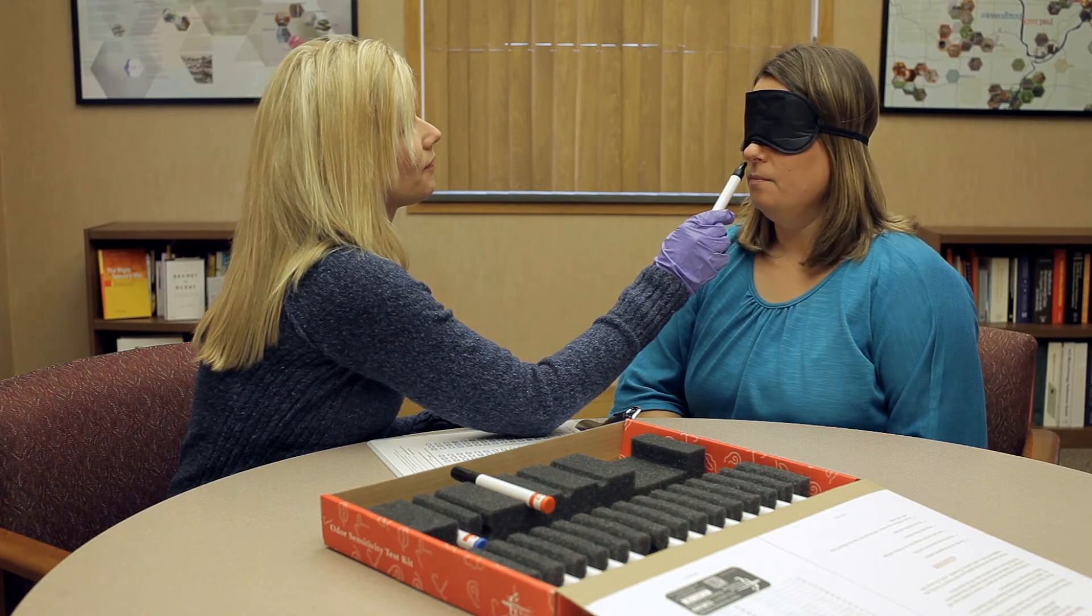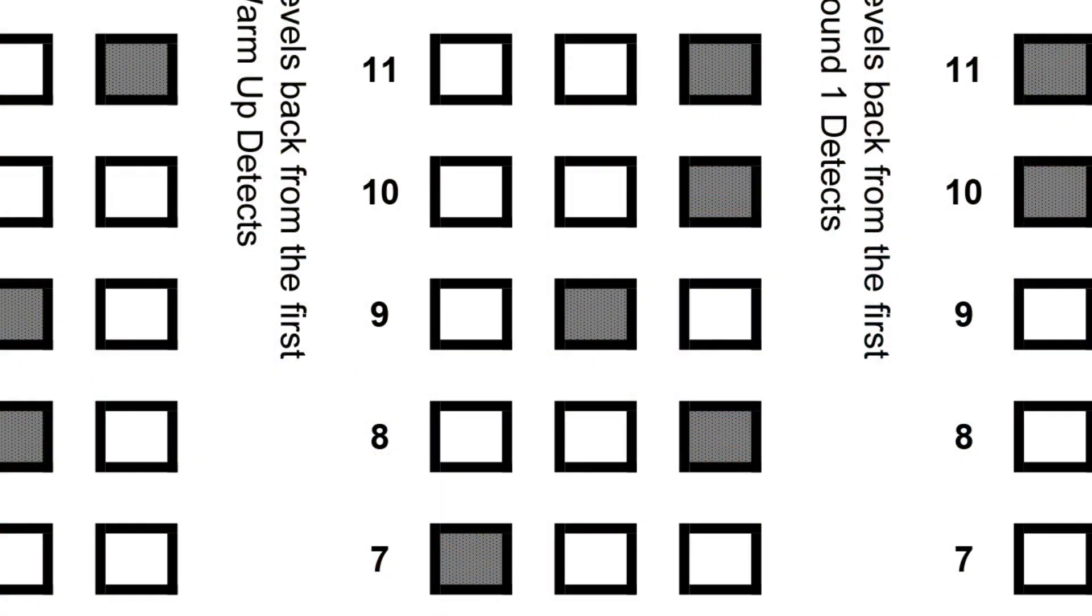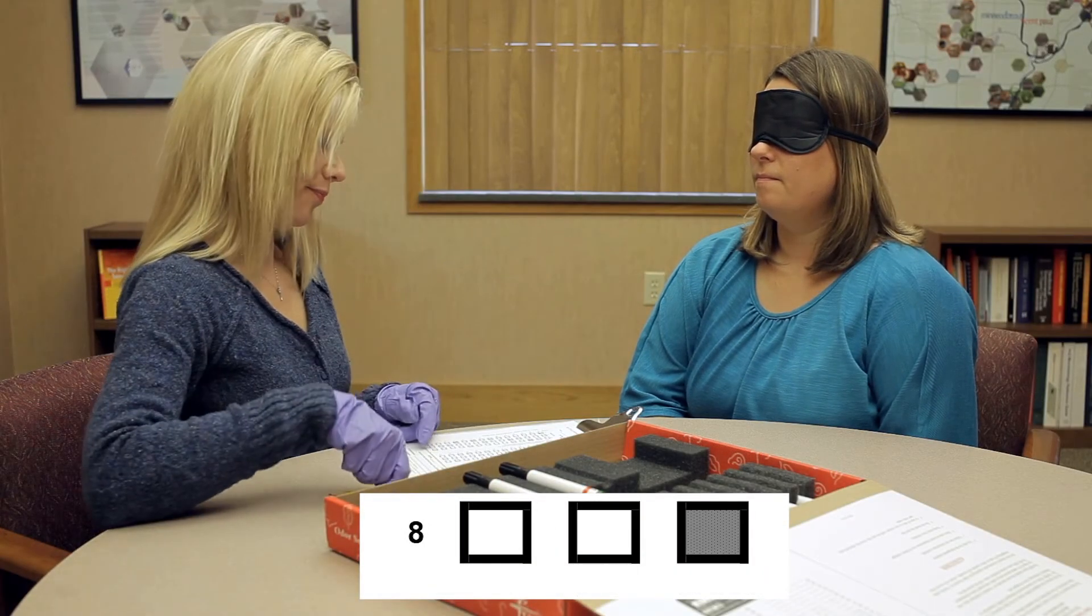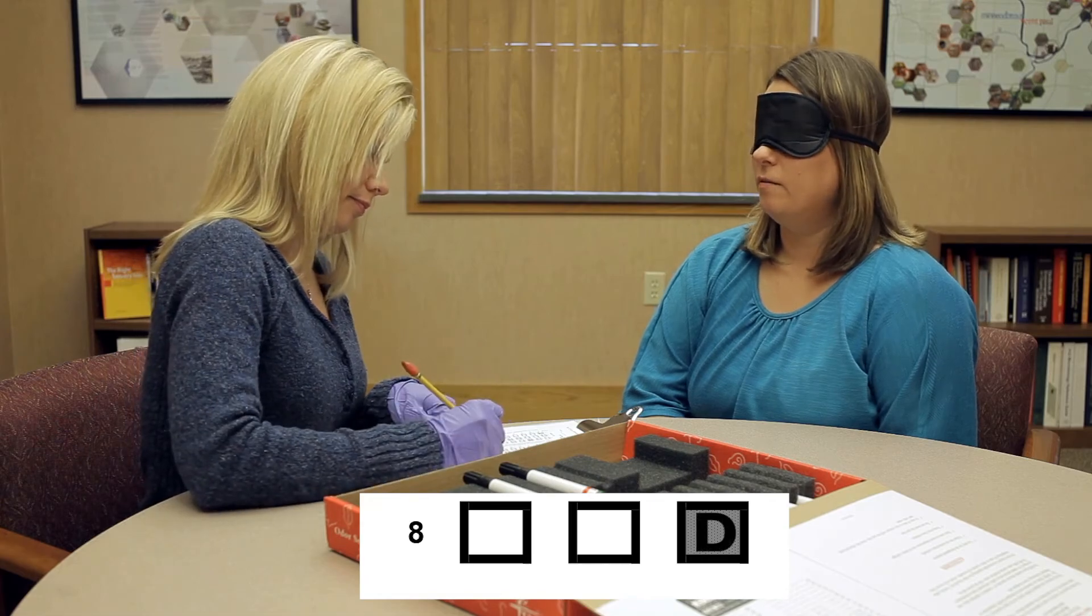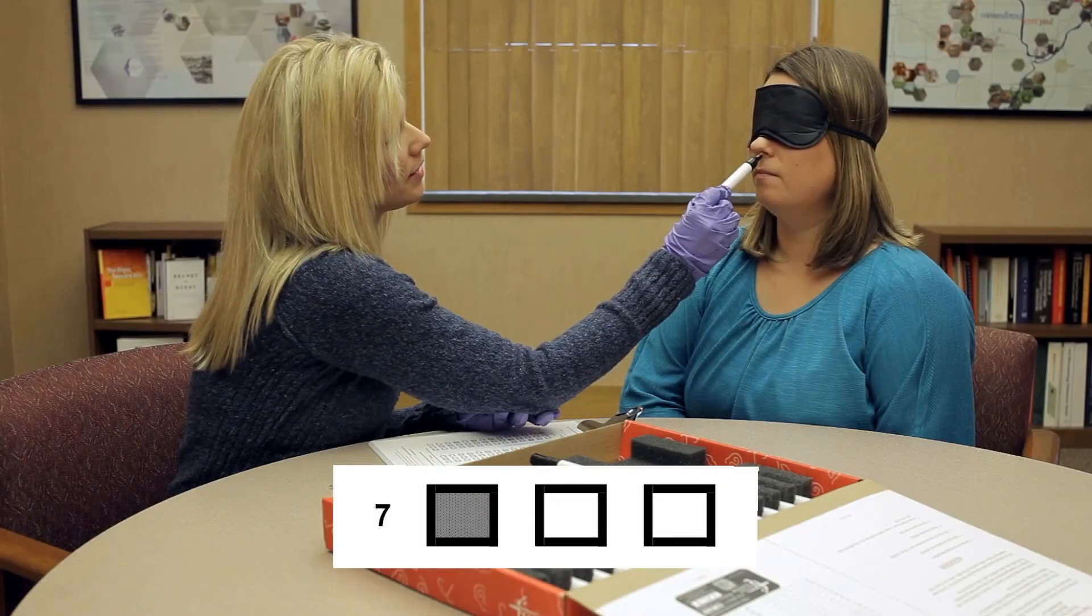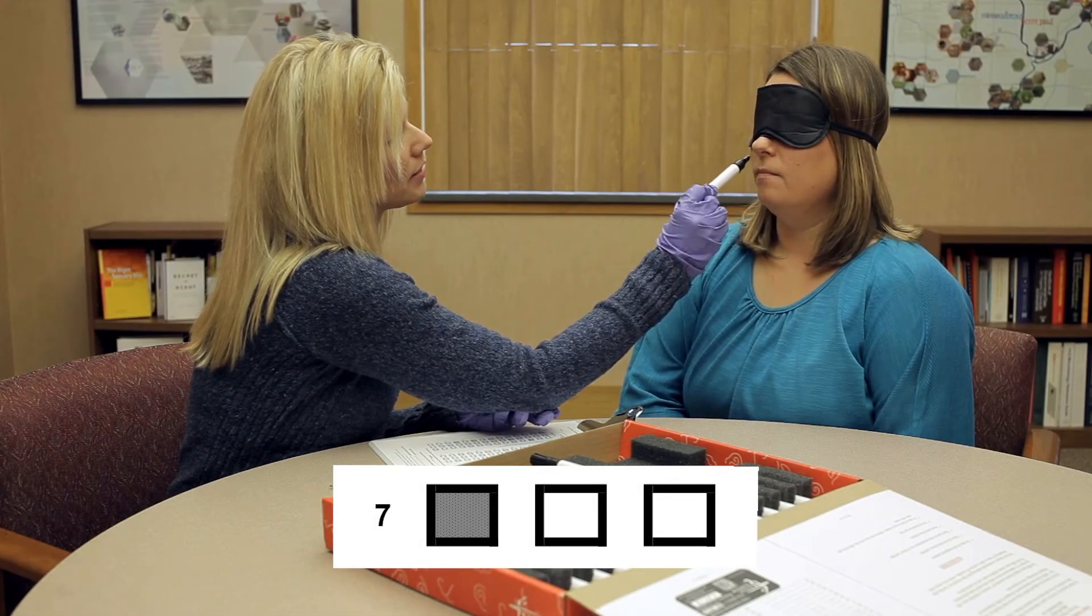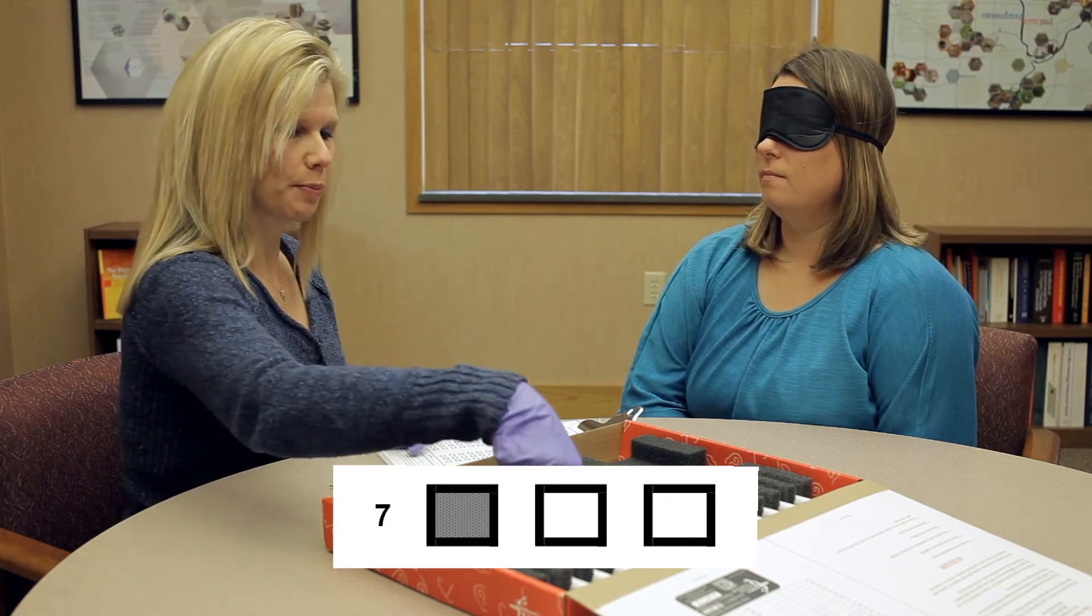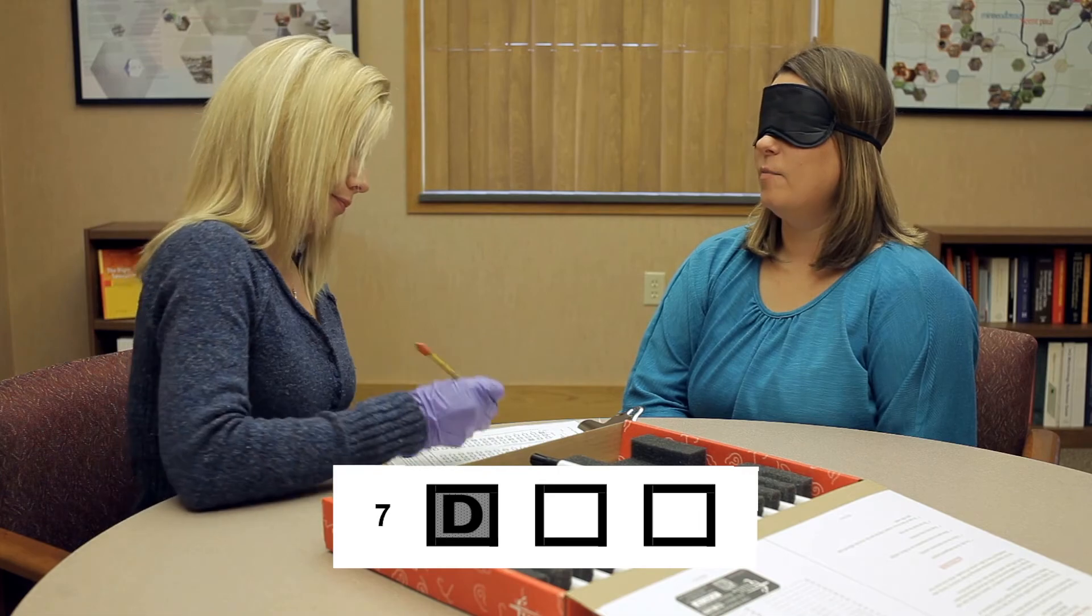Sniff, sniff, sniff. After presenting the sequence for number ten and number nine pens, the test individual is completing the number eight pen sequence. Which pen? I detect number three. The pen sequence for number seven is presented as a final confirmation of the detection response. Which pen? I detect number one. Round number one was stopped after this confirmation.